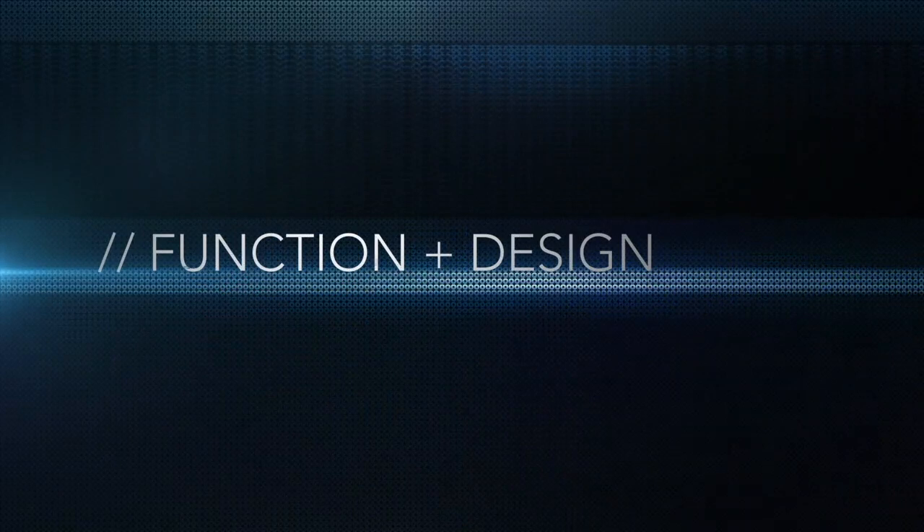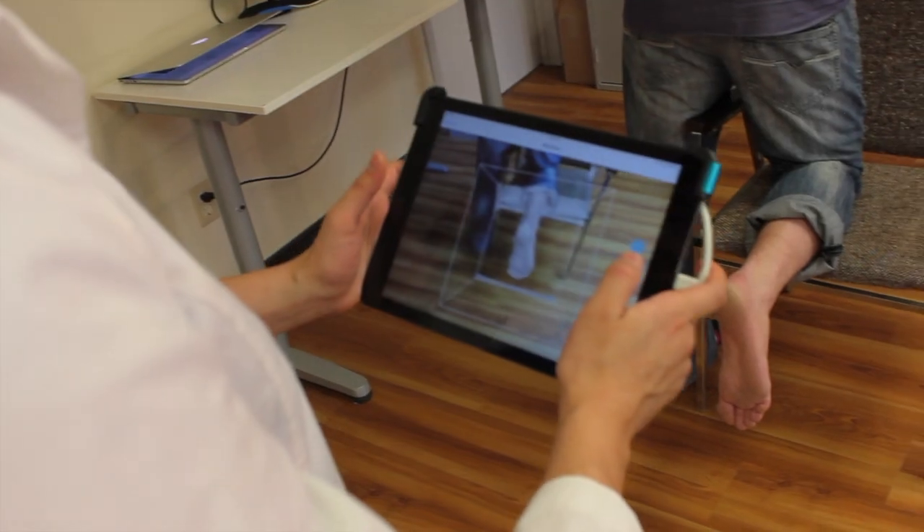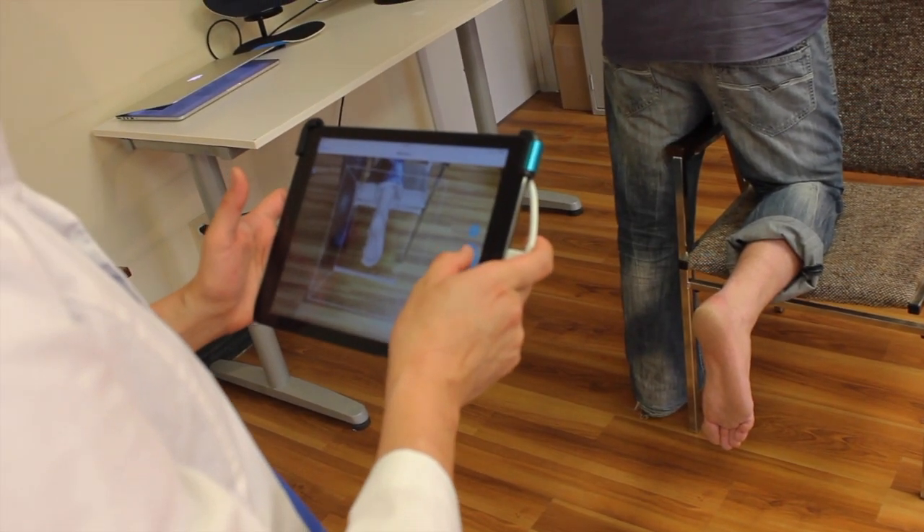The scanner works by capturing a pattern of invisible laser projected light, allowing our proprietary software to record thousands of measurements a second. This creates a volumetric matrix and a precise digital replica of the foot being captured.